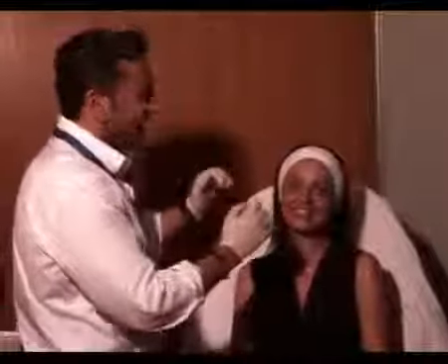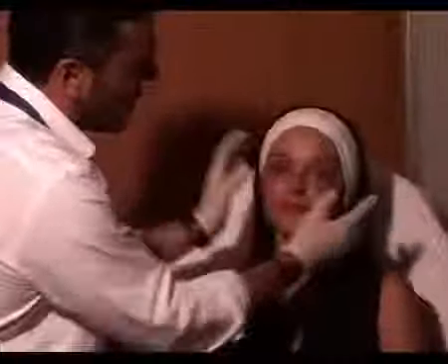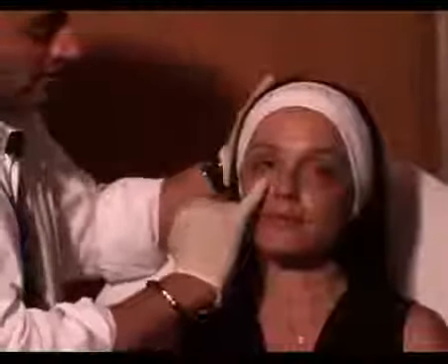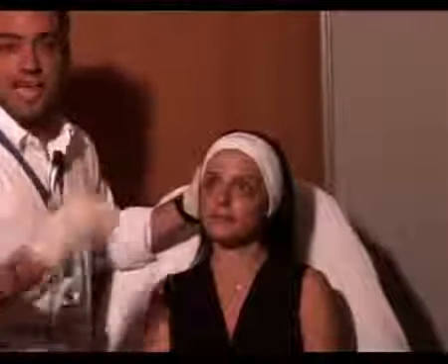All right, so this lady, as you can see over here, has a little bit of T trough depression going on, in addition to a little bit of cheek depression happening in the mid-fat area. So mid-facial fat atrophy. When it comes to treating the area, if you're going to be choosing just one area, do not inject the T troughs first. The most important area is to inject the mid-cheek. After injecting the mid-cheek, you can start treating the tear troughs if you can see any deformities.